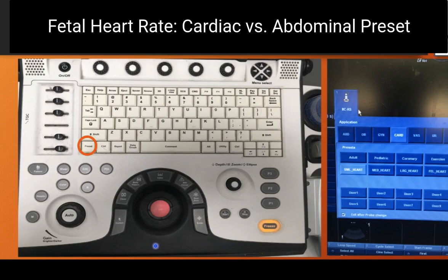In general, there are two ways to get the fetal heart rate: first in cardiac mode, versus in abdominal mode or preset, and I will teach you both. In order to choose a preset, you need to find the button on your machine. As you click on preset, you will have different options. I'm going to start with the cardiac preset, and then we'll go on to the abdominal preset.